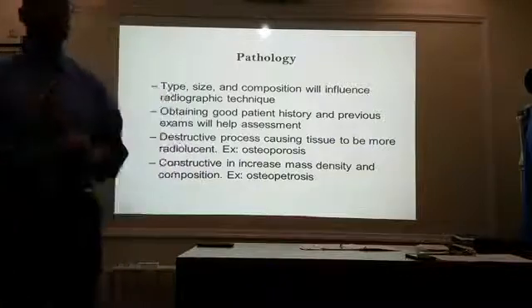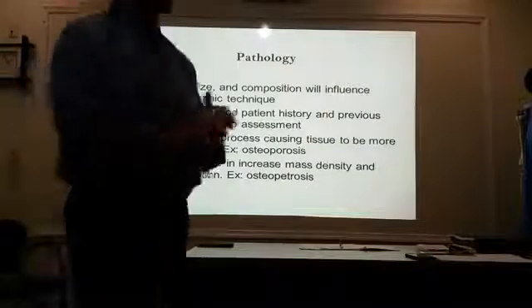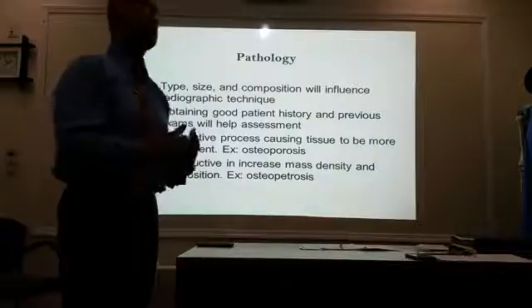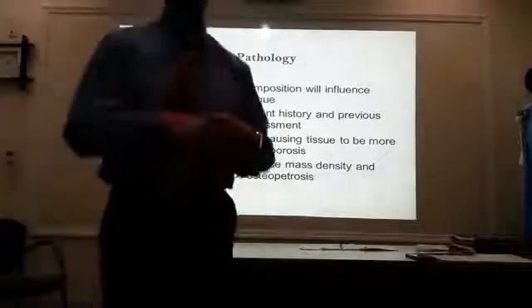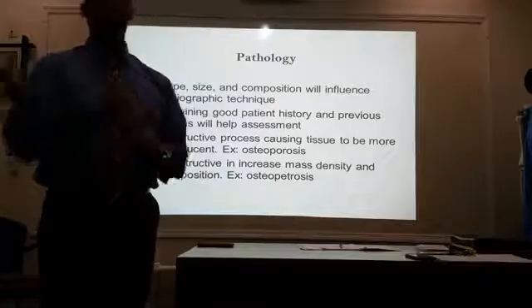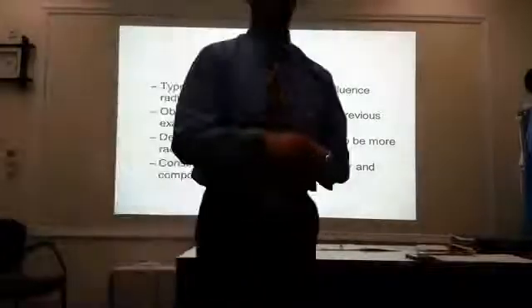Okay? So here's an example. I have a patient coming in for a chest x-ray. I'm going to ask him, Mr. Jones, why are you here? Well, I'm having some chest pain. Do you have any history of any type of heart or lung conditions? Yes, I have asthma. Right then and there, it's going to tell me, oops, I need to adjust my technical factors.